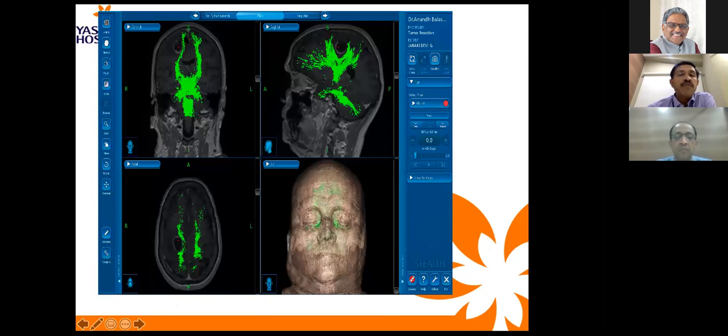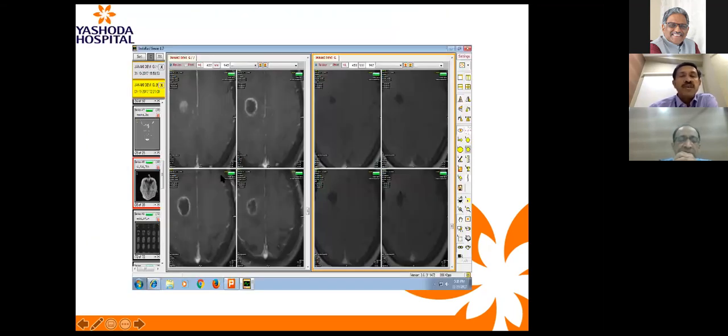Here, another example of a corticospinal tract, which is being nicely deviated by this lesion sitting out here. You can see that it is pushing the corticospinal tract. This patient indeed had a deficit, so there is no way you can do a functional intraoperative mapping because the patient already has a deficit. So you cannot elicit movements in an awake craniotomy because the patient already has a problem. But as you can see in the DTI, the fibers are still preserved. That means it's because of compression. So you need to resect this, but preserve these fibers. That's the main aim. So that's what we have done.